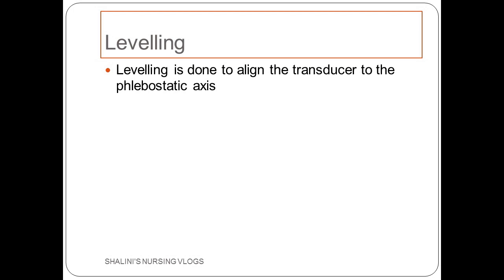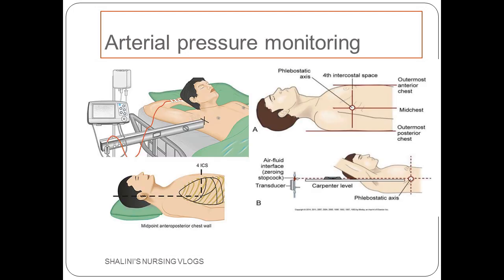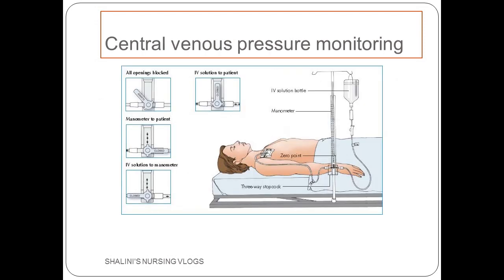Leveling is done to align the transducer to the phlebostatic axis. In case of arterial pressure monitoring, you will level the transducer to the fourth intercostal space of the patient — this axis is called the phlebostatic axis. In case of central venous pressure monitoring, the transducer also has to be leveled to the fourth intercostal space, which again is the phlebostatic axis.